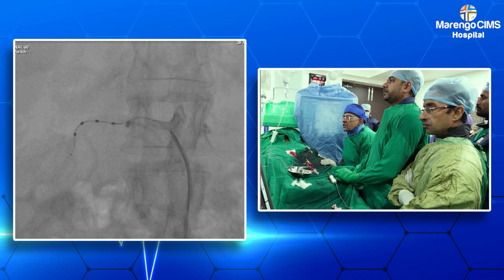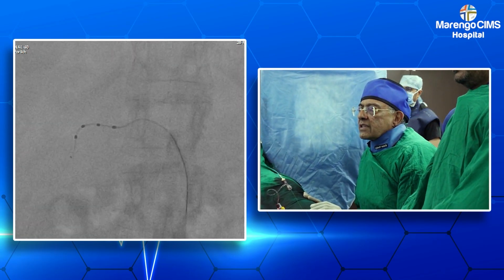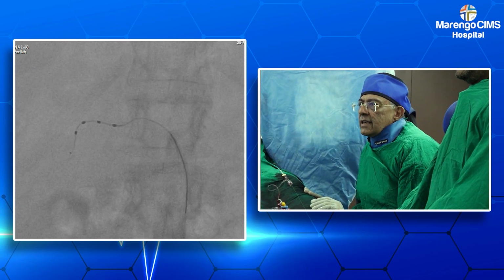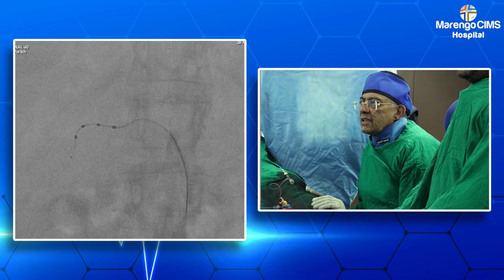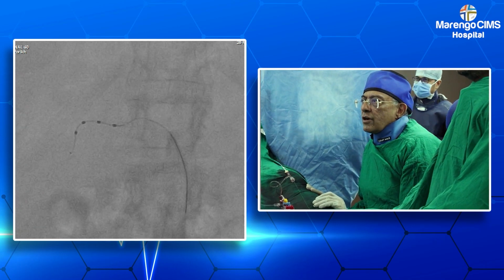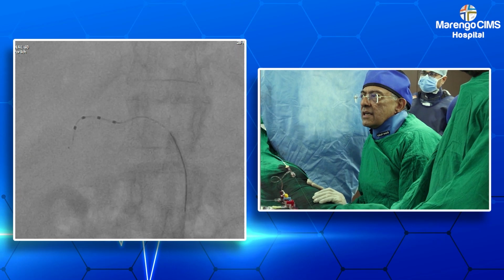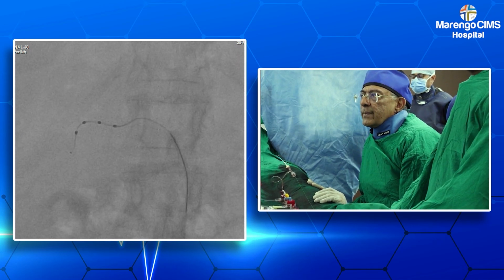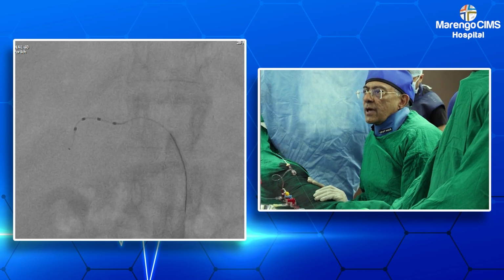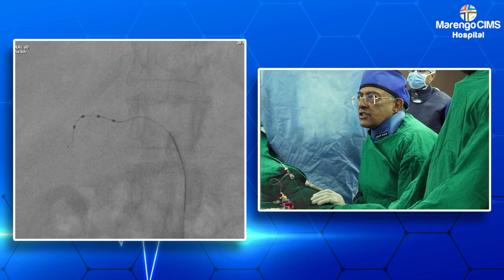The beauty of this spiral catheter is that it is non-obstructive. Since it's non-obstructive, we are not worried about occluding the artery or thrombosis in the artery. However, since the ablation will involve some degree of burn and heat, adequate anticoagulation is required. Single antiplatelet is strongly recommended, mainly aspirin. However, patients who have had intervention before and are on dual antiplatelet, that is permissible. You do not need to stop the second antiplatelet agent.